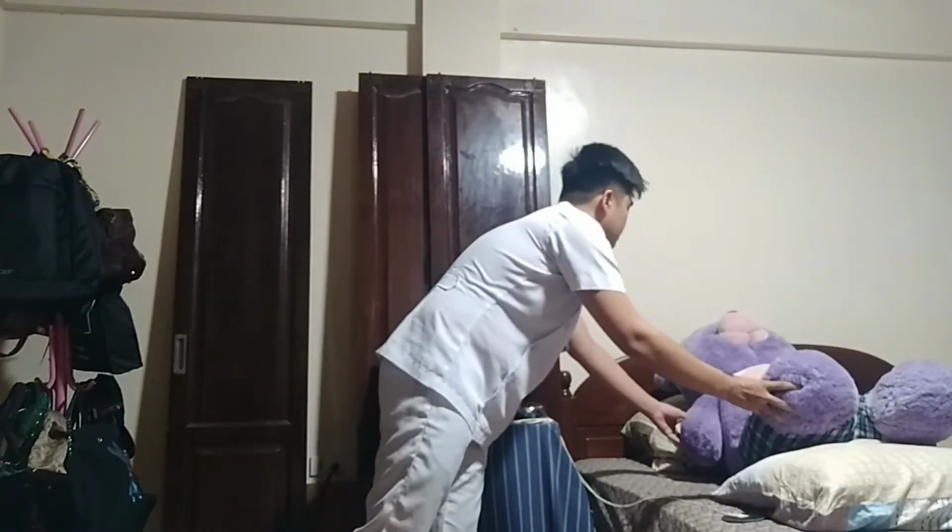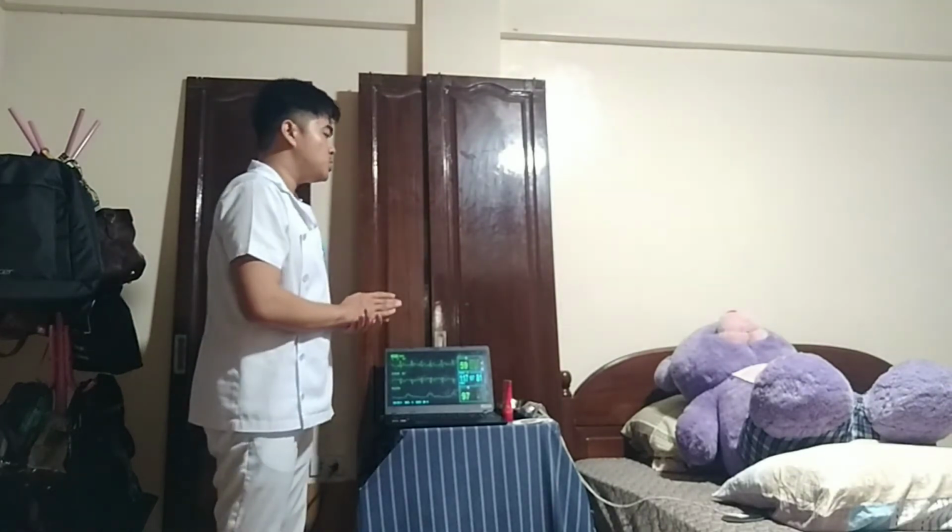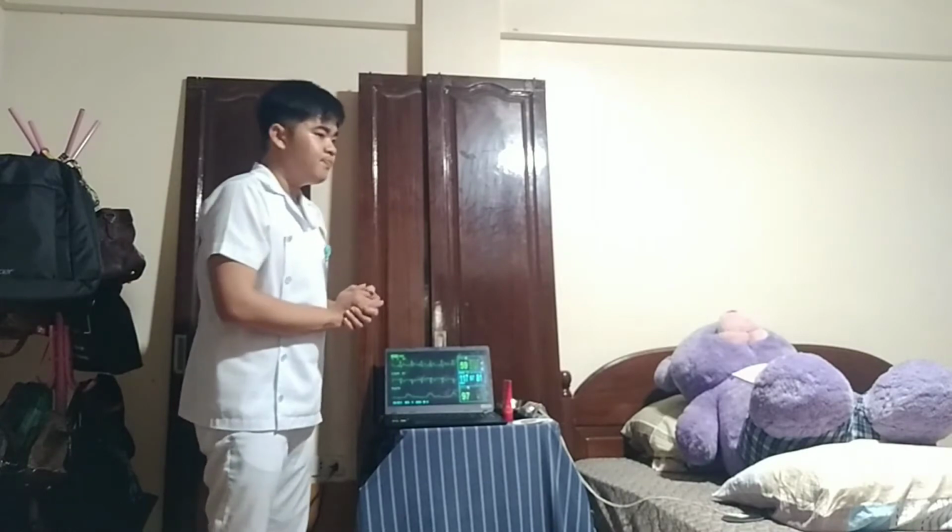and we're going to elevate the head of the bed or put at least 2 pillows to promote comfort to the client. And we're going to ask the client to expose his arms and legs and drape the patient properly. And we're going to ask him to relax his arms and legs. Sir, please expose your arms and legs and relax them at your side.